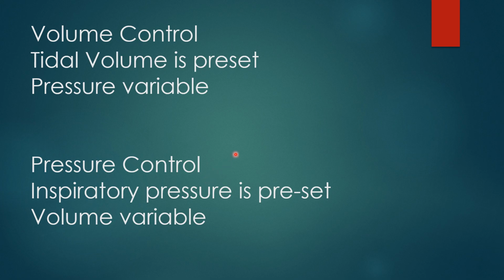What will be best for the patient is doing what you feel most comfortable doing, which is usually what you've been doing all along, because you'll find some hospitals where all their ventilators are in pressure control. So the RTs working for years and years just using pressure control are not as familiar with volume control, although any respiratory therapist should be able to use volume control or pressure control, and both are just as safe and just as effective for the patient.